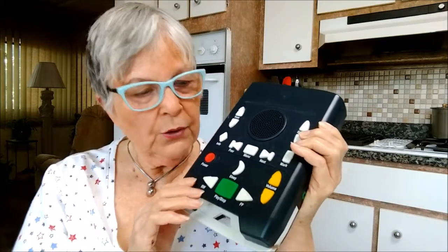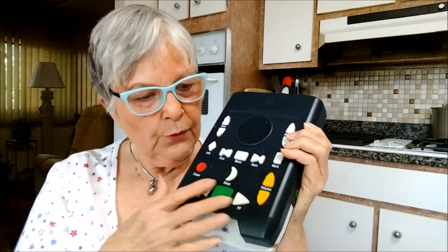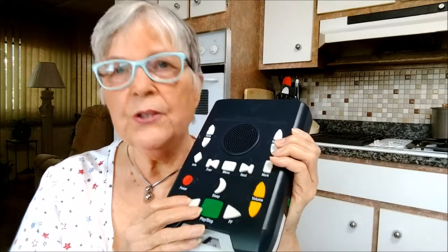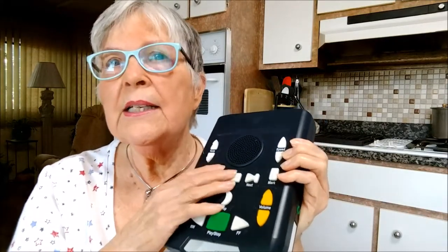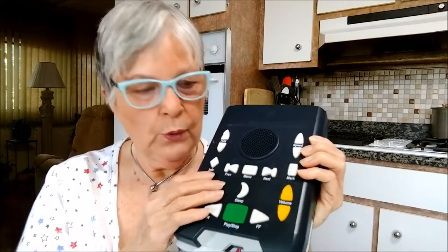One of the coolest things about this is that all these different buttons have a function, and you don't have to totally memorize them. Every one of them is tactile — you can feel them when you touch them.